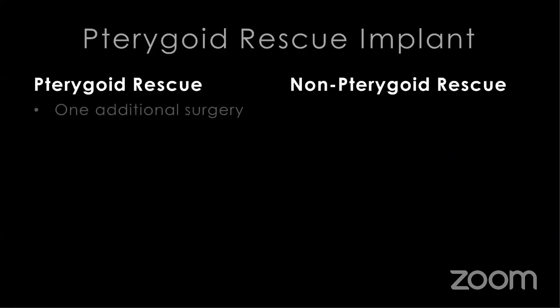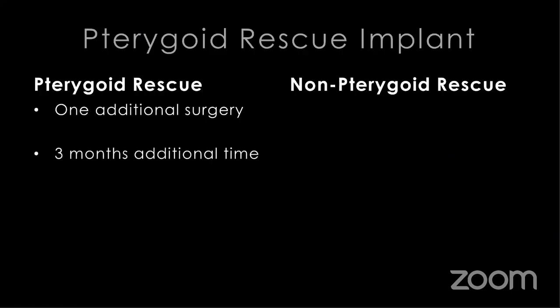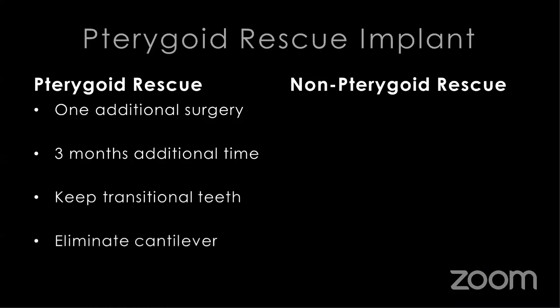So if we look at this particular case, by placing a pterygoid rescue implant, we only had to do one additional surgery, a little bit of additional healing time. They were able to keep their transitional teeth with very minimal modifications. And when they smiled, they were able to see all of their teeth without any changes. And then as an added benefit, we were able to eliminate the cantilever.